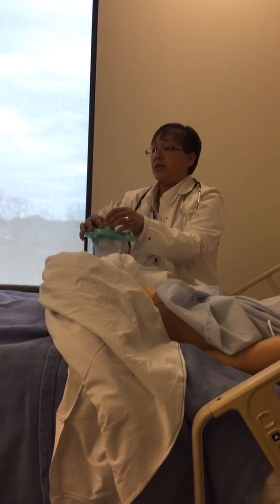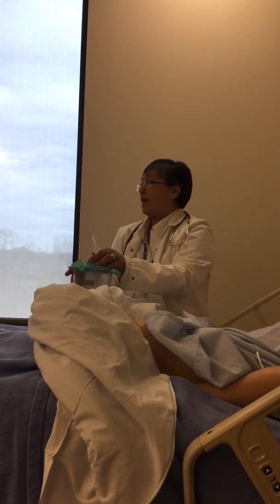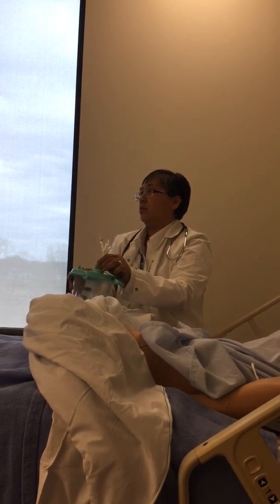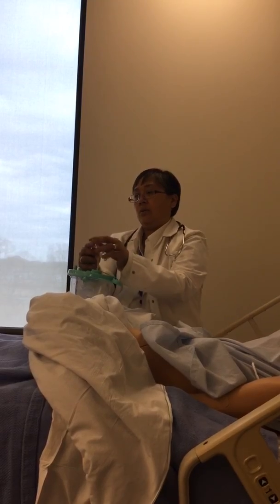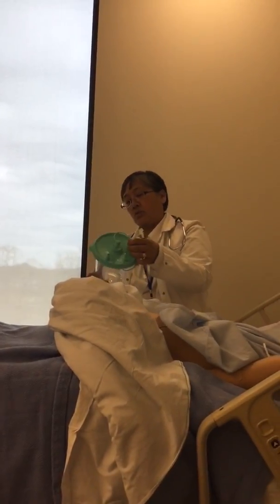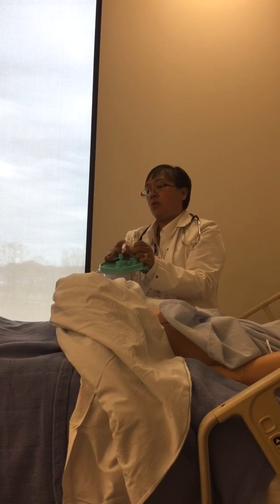So it needs that so that it doesn't create a vacuum inside the stomach sometimes. It just keeps things in place. So they always need something there that would help keep it in place. It could also be for a balloon of some sort, to keep it in place so that it doesn't go in and out. So I'm going to be using this port here.